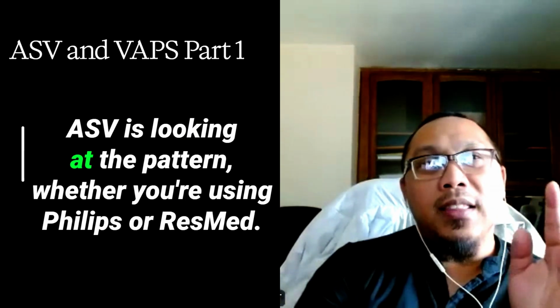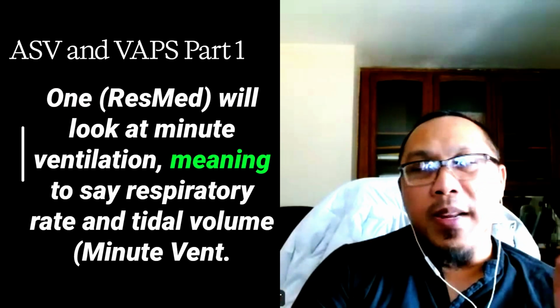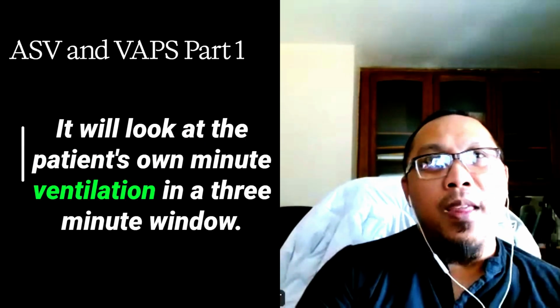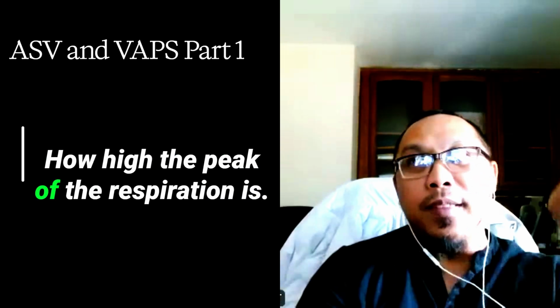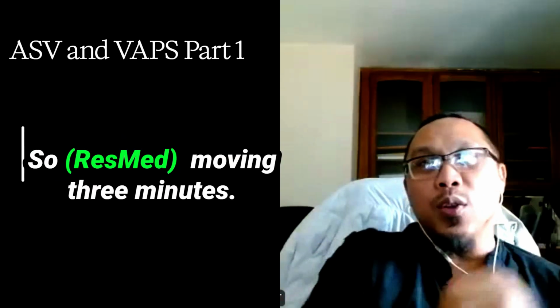So let's expound on that. ASV is looking at the pattern, whether you're using Philips or ResMed. One will look at minute ventilation, meaning respiratory rate and tidal volume. It will look at the patient's own minute ventilation in a 3-minute window. Philips will look at the patient's own peak flow, how high the peak of the respiration is, but it looks at that on a 4-minute moving window. So ResMed moving 3 minutes, Philips moving 4 minutes.